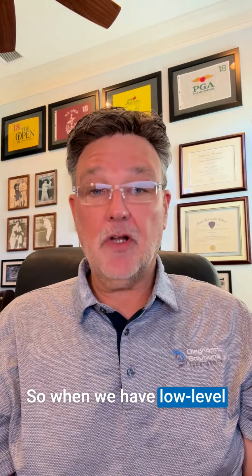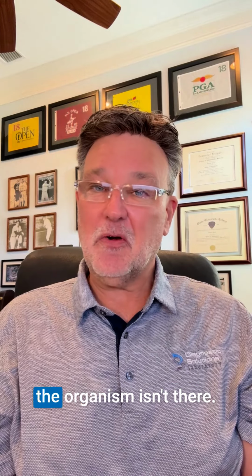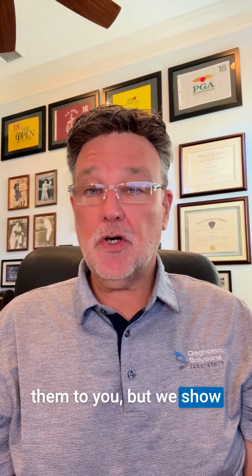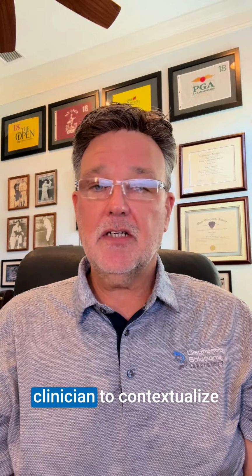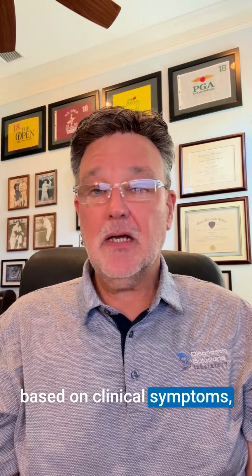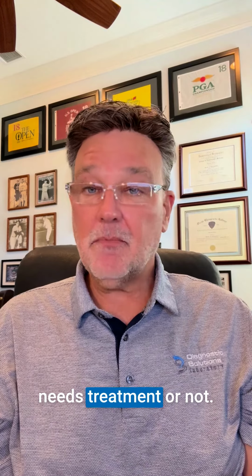So when we have low-level hits, they are hits. The probes don't hit if the organism isn't there. We are choosing to report them to you. But we show you the level versus a clinical reference range, and it's up to you as the clinician to contextualize that information and decide based on clinical symptoms, antibiotic use, and other factors whether it actually needs treatment or not.